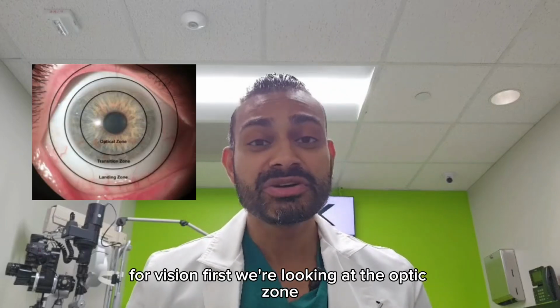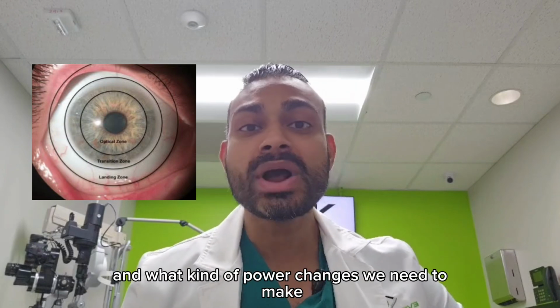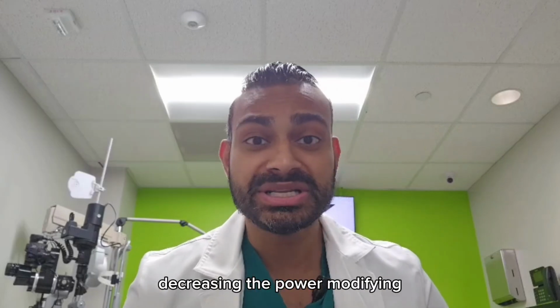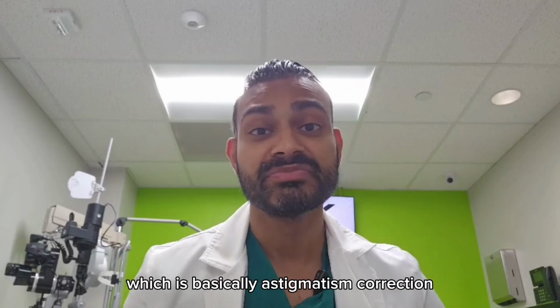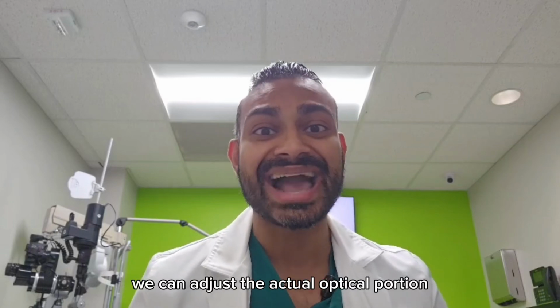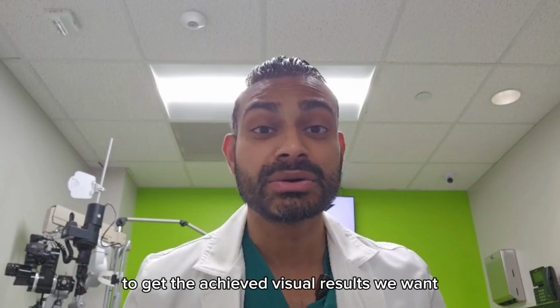So for vision, first we're looking at the optic zone, what diameter that is on the surface of the lens, and what kind of power changes we need to make to give optimal vision. So that could be increasing the power, decreasing the power, modifying and adding what's called front surface toricity, which is basically astigmatism correction onto the front part of the lens. So there's lots of different ways we can adjust the actual optical portion of the scleral lens to get the visual results we want.